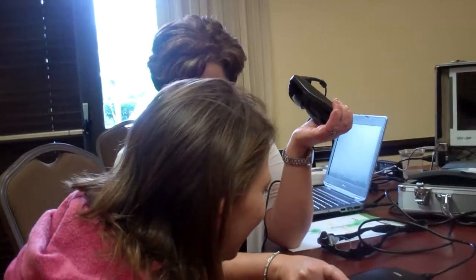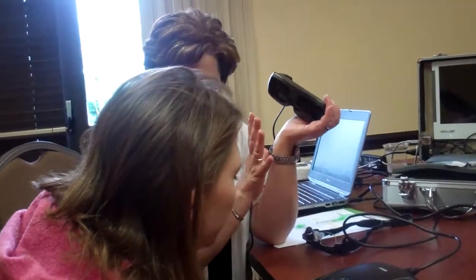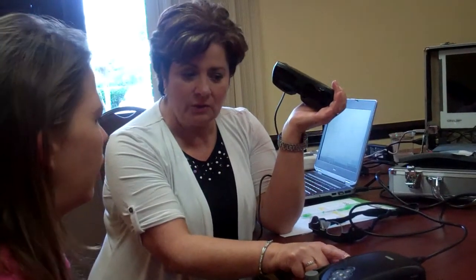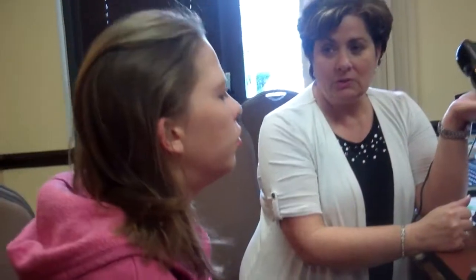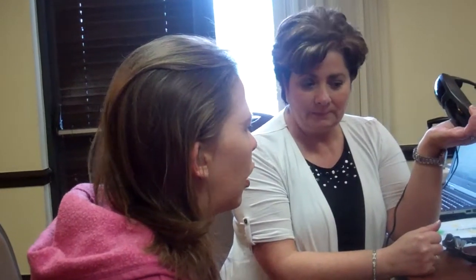Whenever you hit that middle dot, it freezes the frame, takes a picture, and saves it on the SD card that's inside the controller. Then down the road, if you want, you can take that SD card out and download the images onto your computer. They're not great high pixel images, but they're certainly a memory that you can look back on. Use it for school and all kinds of things.